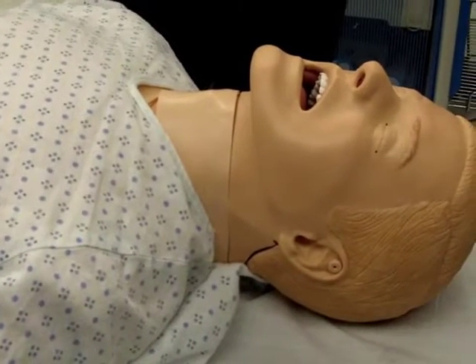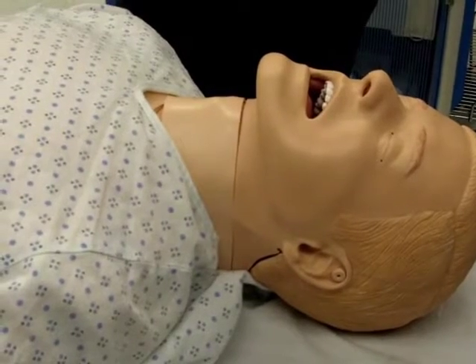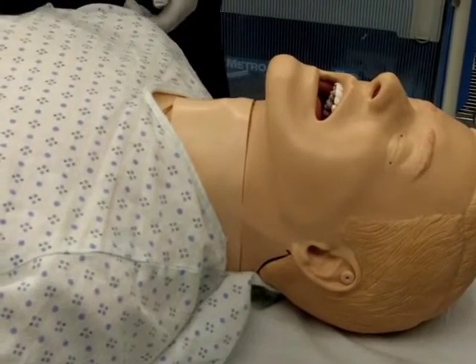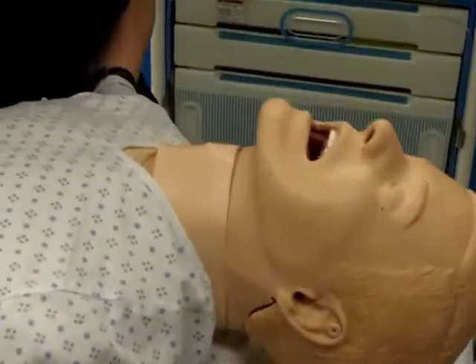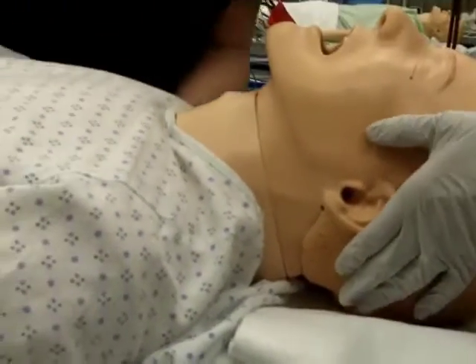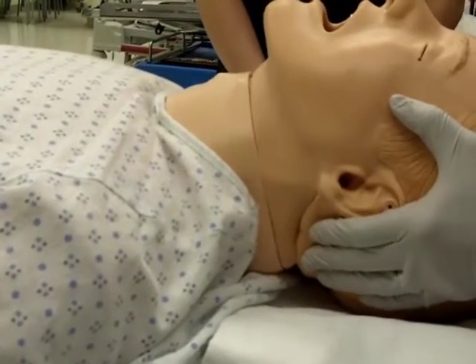Raise the height of the bed to allow for a comfortable assessment of the airway by the provider. Align the ear canal with the sternal notch. Place the patient in a sniffing position by slightly extending the neck.